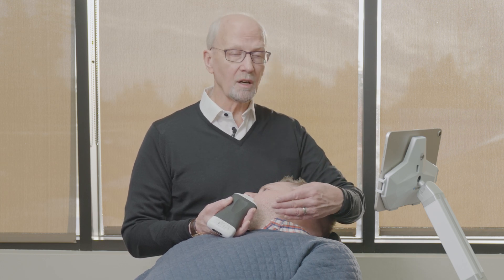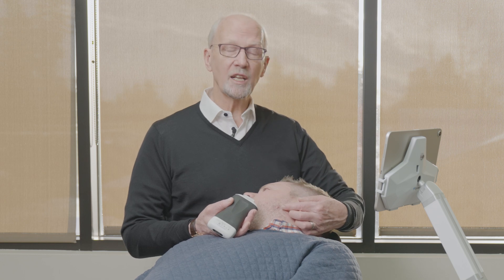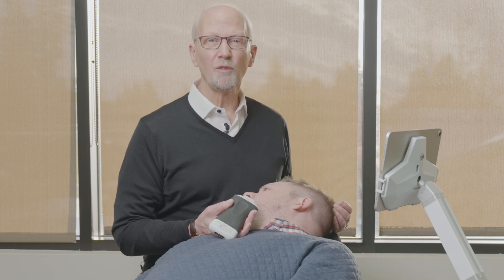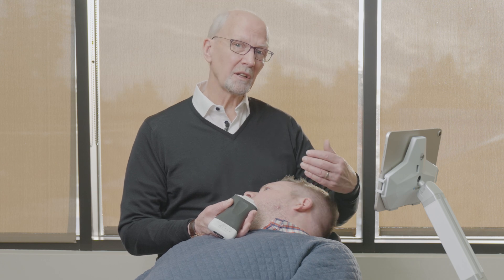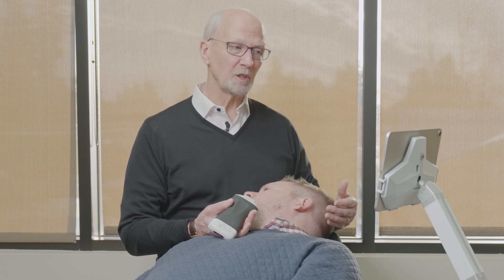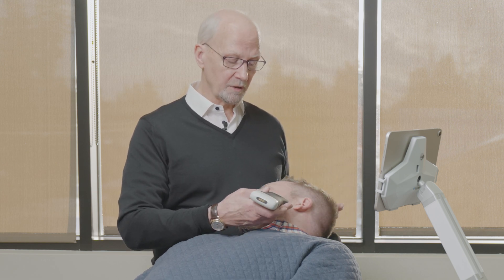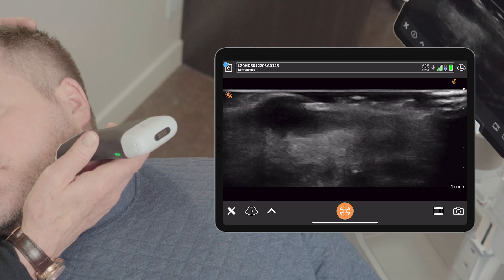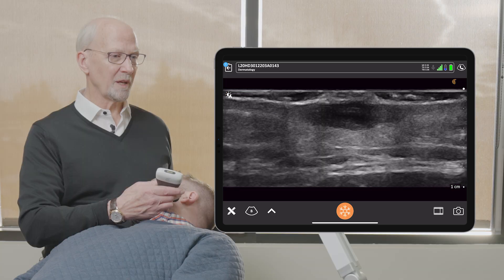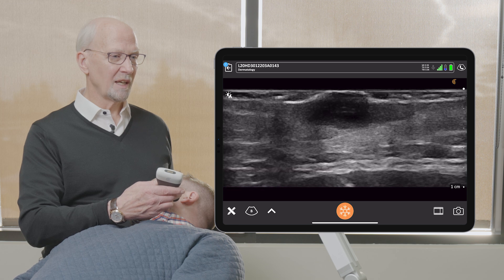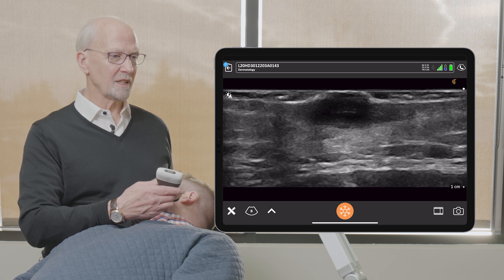We can see here on our patient this little change on the cheek. This has been going on for about four months and it fluctuates in size. You can see that there's a nodule anterior to this, there's atrophy, and you can tell that the inflammation has been going on for a while. So we're going to bring our ultrasound device up and look at the lesion to see a number of things that will help us understand it.